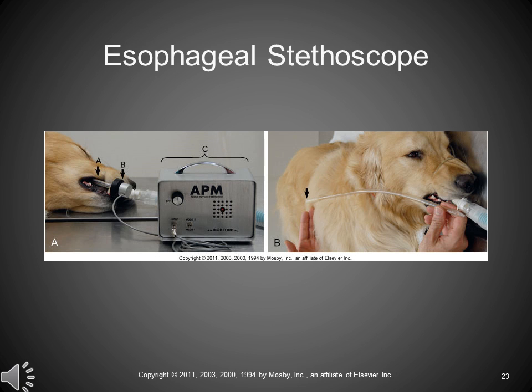Hook it up to that machine, and you'll hear lub dub, lub dub, lub dub, and then you'll hear the sound as they breathe. Great stuff. Cheap. Good information.